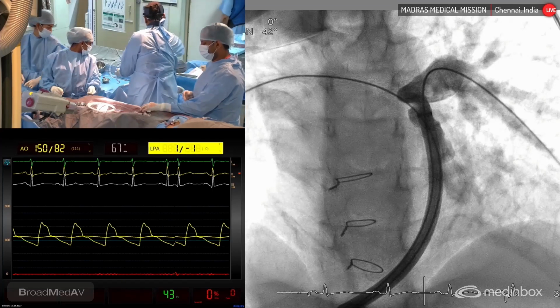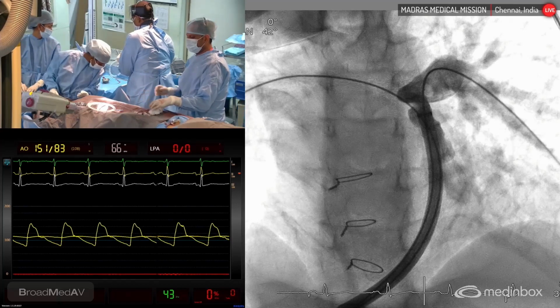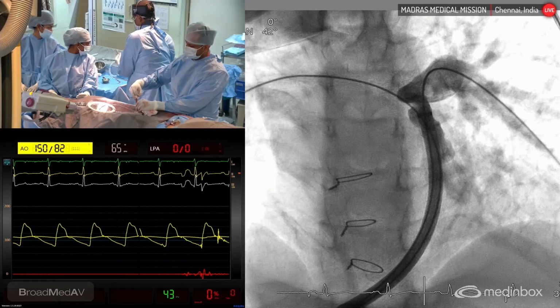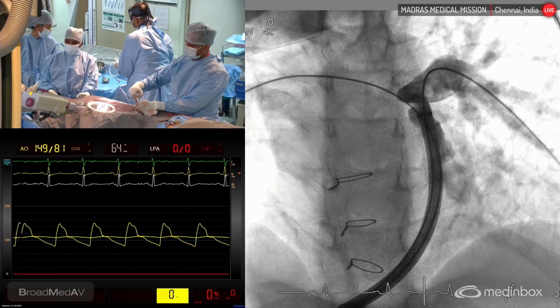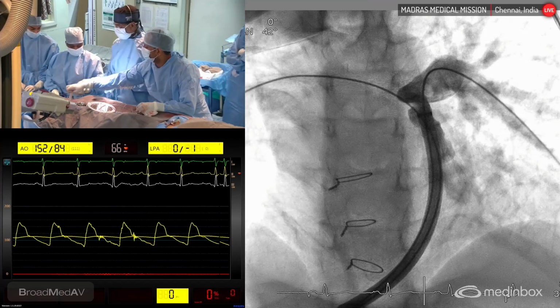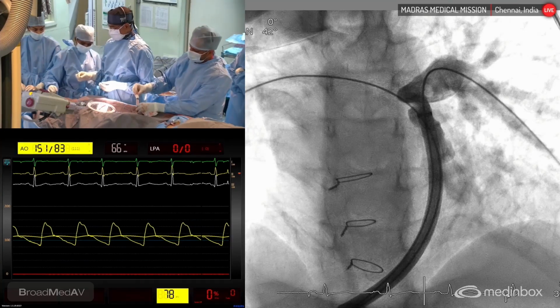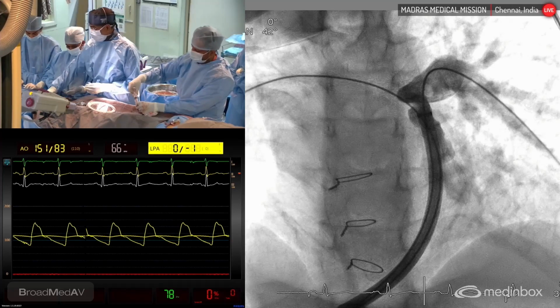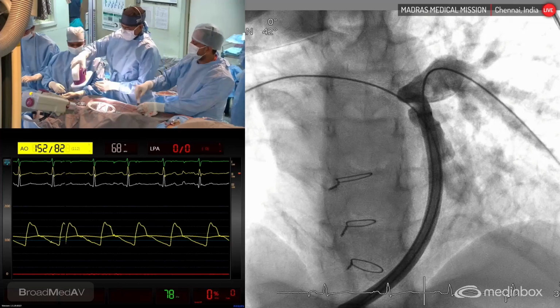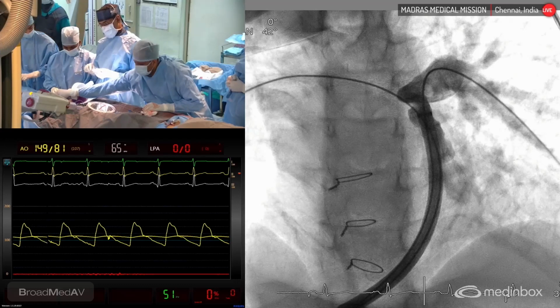I'll dilate it initially with a short dilator. I need a little larger dilator, maybe something like an 18 dilator, so that we are going to mount both these balloons. Crimper ready? Yes, sir. So we have a dedicated crimper for this.